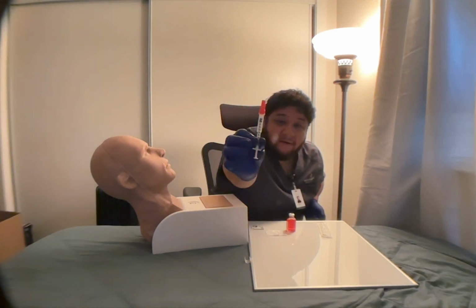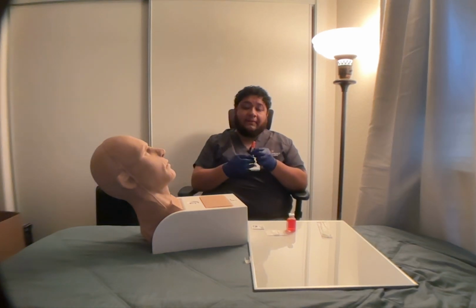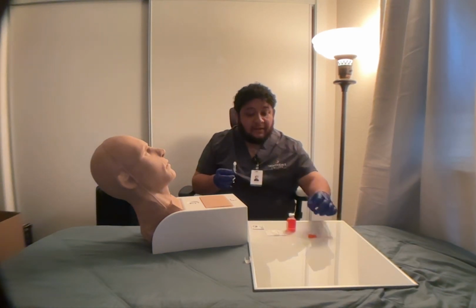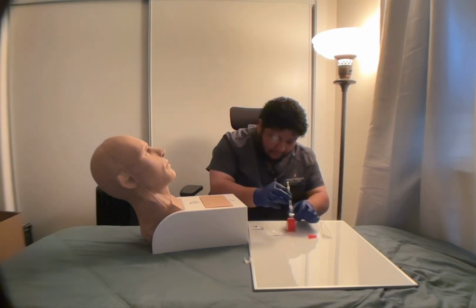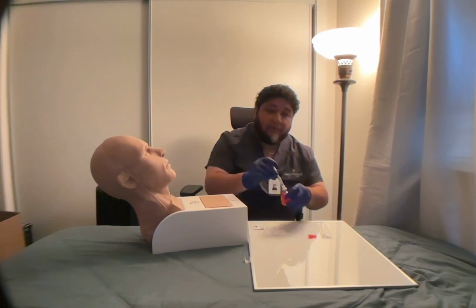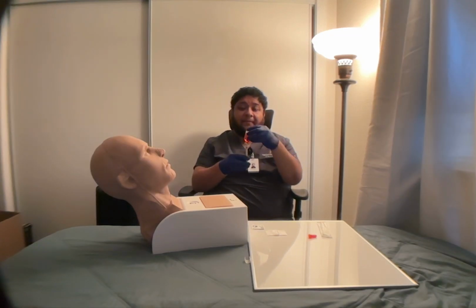0.1 milliliters of air. You can see that. Okay. So now I'm going to go ahead and remove the cap and inject the air into the vial, the medication vial. Now I'm going to invert the medication vial and draw the same amount, which is 0.1 milliliters.